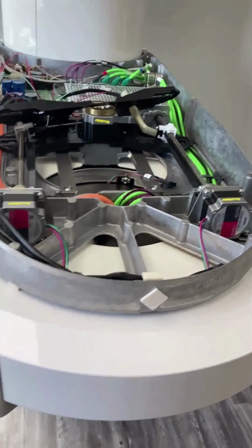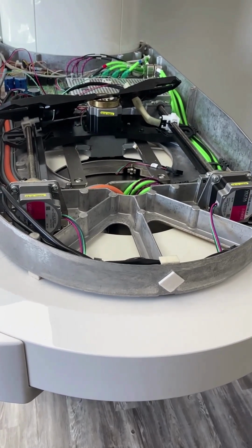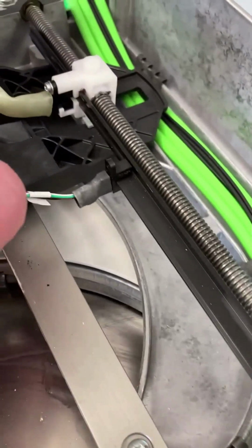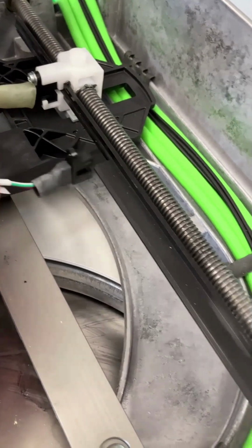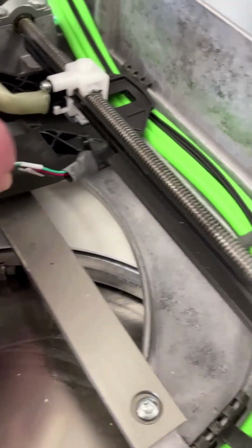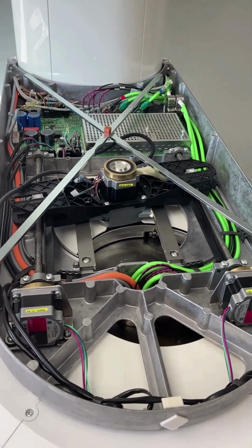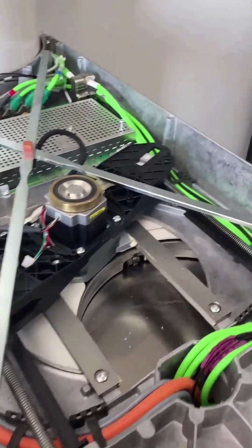So there's literally like 6 screws that you take out that holds this clamp together, and then you can separate it. And you can take a stubby Torx T10 and reach in there and remove that faulty barrier and install the good light barrier. But as you can see in the first video, when that light barrier fails, it's no longer working, it's no longer acting like the limit switch. When that light barrier has failed, the software doesn't know at what point of the travel the rotation is. And so when you hit that return key and the unit tries to return to its home position, it goes way past the stop point because of the faulty light barrier, and essentially drives itself to the point where it cannot be driven any further, and basically just crashes into itself.